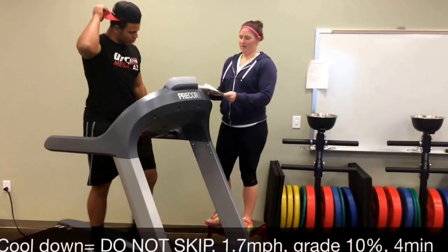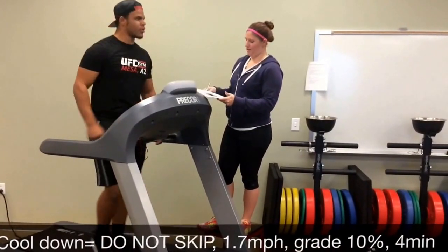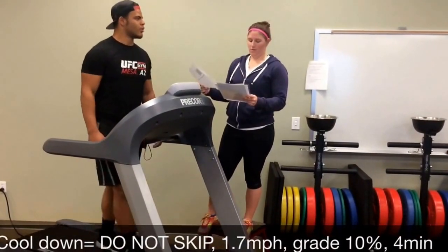Back to the first stage speed for the cool-down, until his heart rate comes down to 120.